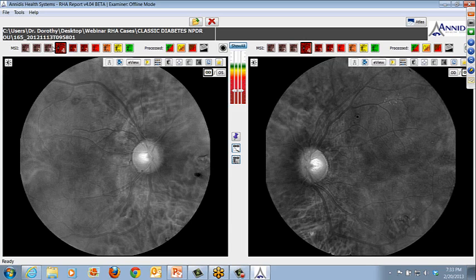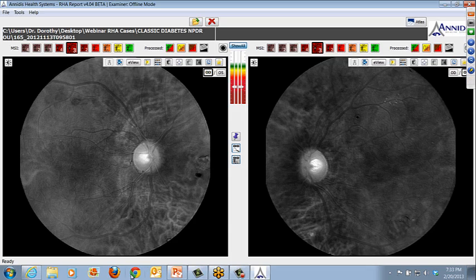And you can also see in the 3s and the 4s that there's some RPE atrophy in a few places here, which is what you would expect in a patient with diabetes, right? Diabetes is a vascular disease that affects the choroid, which affects the RPE, so it's not unusual, and you will see more RPE atrophy that you might not have appreciated before in patients with diabetes, and certainly with diabetic eye disease, diabetic retinopathy. They could, of course, have comorbid presentation. They could also have macular degeneration as well as this type of clinical presentation.